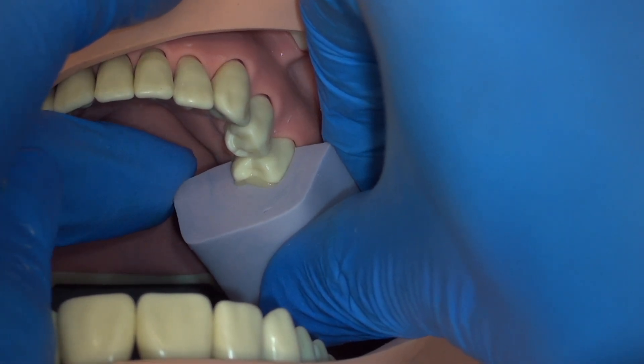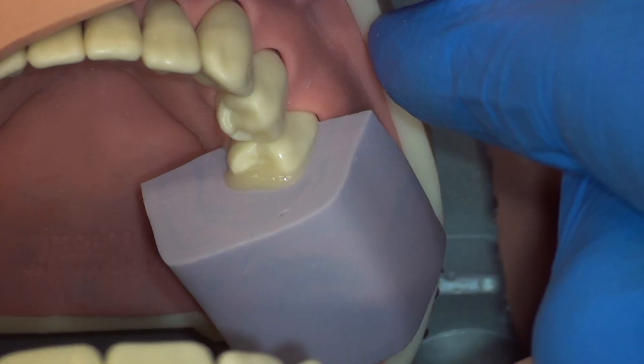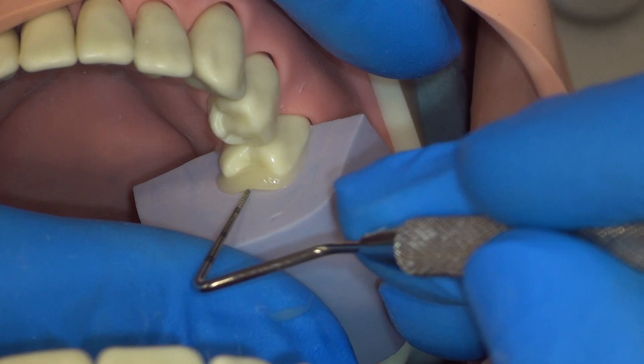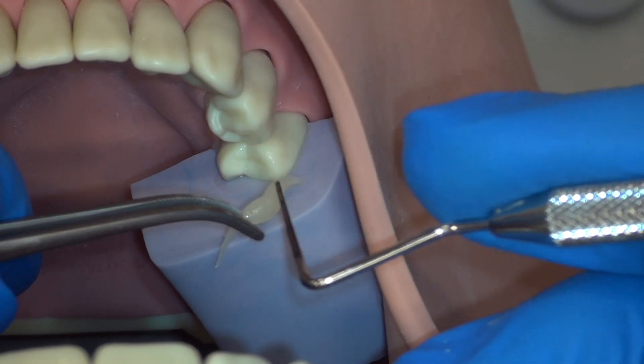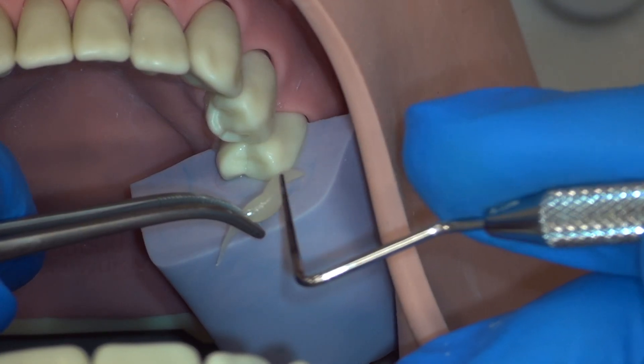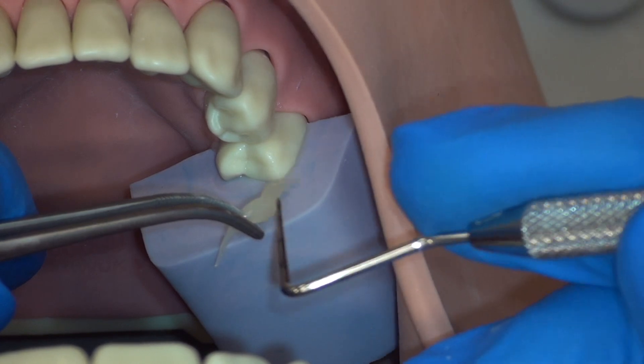We seat the filled putty intra-orally and ensure that the seating is complete. As we remove the small amount of excess, we can visually confirm that the putty was seated perfectly. We can keep this small amount of excess and use it to determine how set our material is.